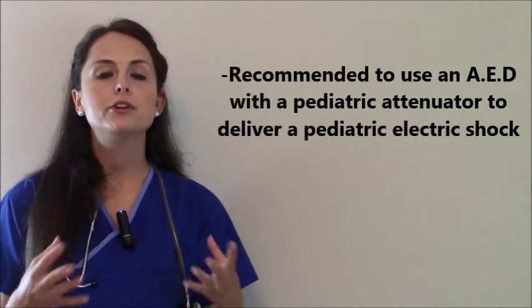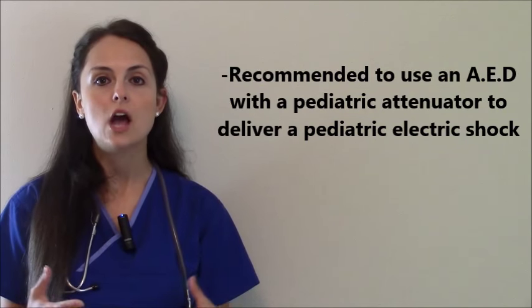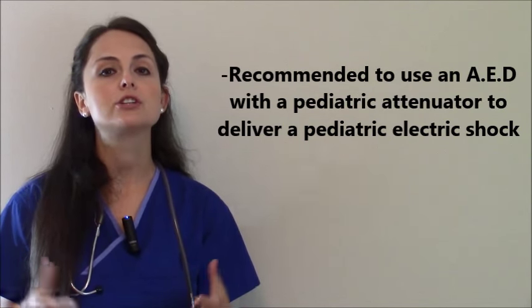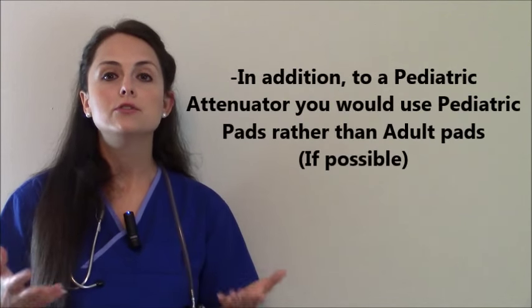It's recommended that whenever you use an AED on an infant, that you use an AED with a pediatric attenuator, meaning that whenever you shock that infant, it will deliver a pediatric dose to the infant. And also, you use pediatric pads.